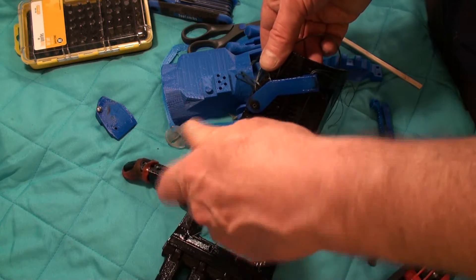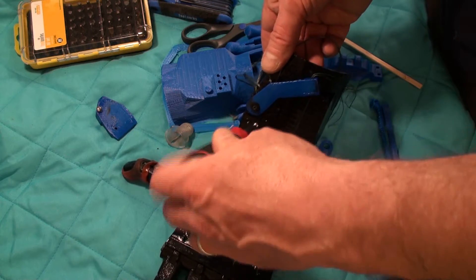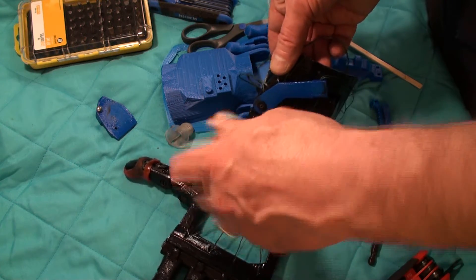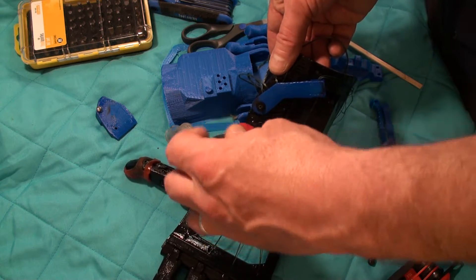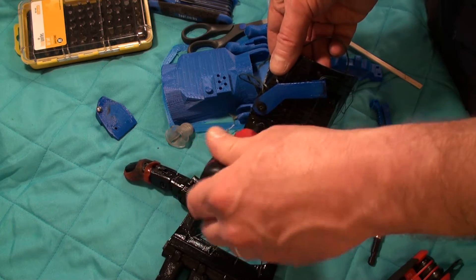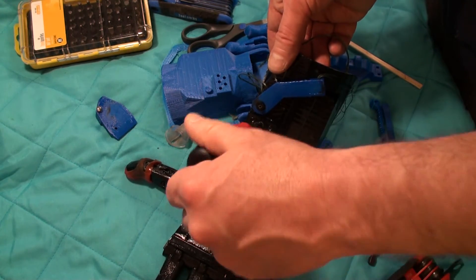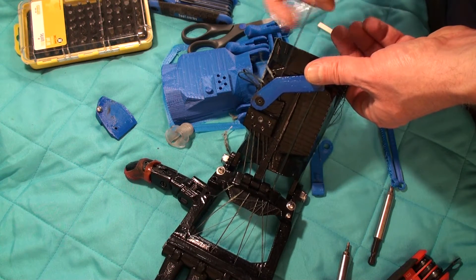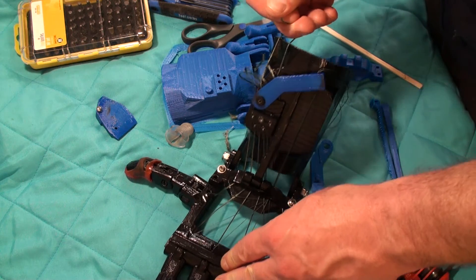You kind of want the set screw mostly in place before you even think about getting the string tensioned right. I can feel when I hit the bottom, so I'm gonna back it up a little bit and just make sure that's the one. Make sure it's as tight as the rest of them.